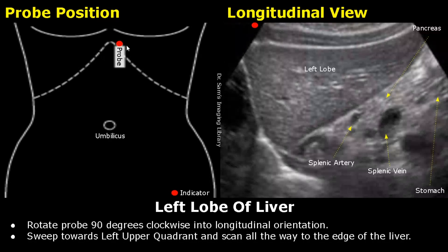Next, rotate the probe 90 degrees clockwise. Now the indicator is directed towards the patient's head and the probe is in longitudinal orientation. Move a little to the left of the midline and scan the left lobe thoroughly all the way to the edge of the liver. You will also see the pancreas posterior to the liver.